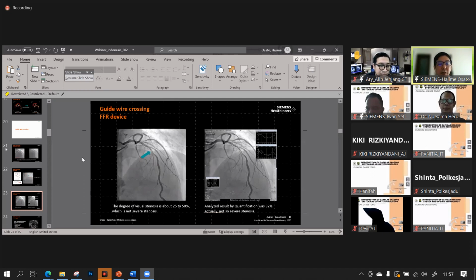Yes, thank you for your question. It is a bit difficult to answer. Actually, we use the systolic phase for the LAD lesion, as it is measured in Japan, and the diastolic phase is used for the RCA. It is very close to the CT coronary imaging.